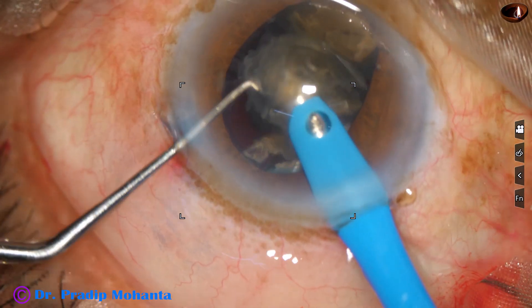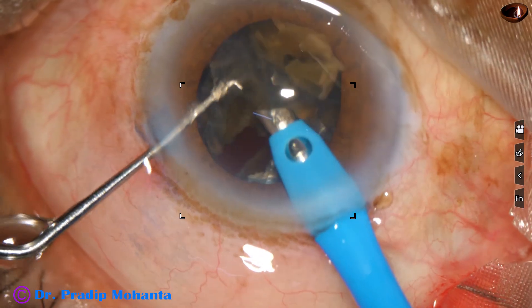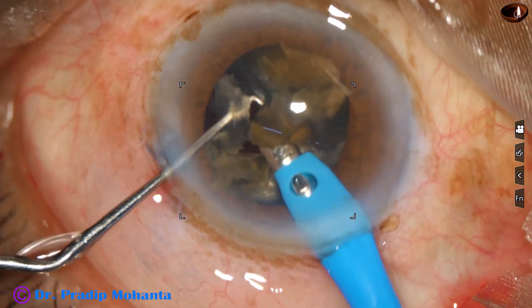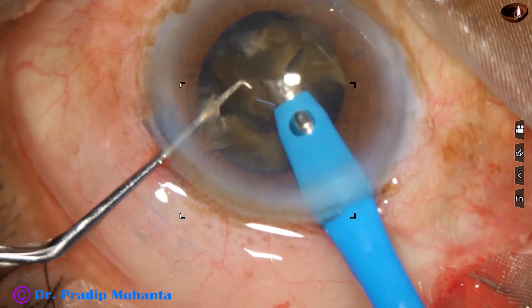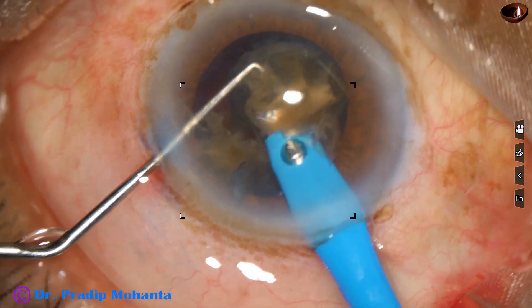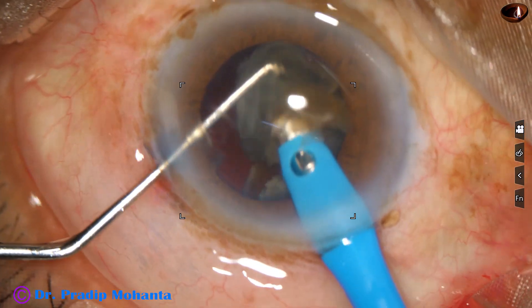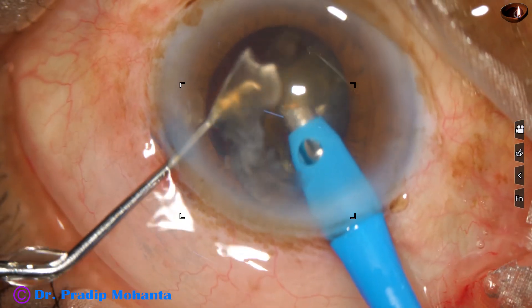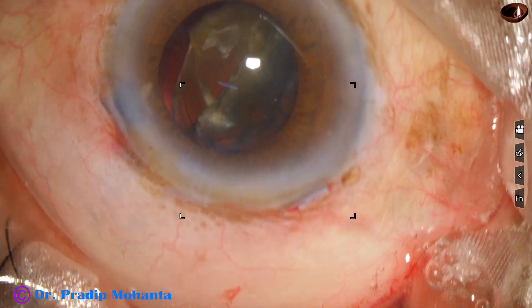Now my plan is to emulsify the pieces one by one. In such cases with a very hard nucleus and a poorly dilated pupil, we cannot see the behavior of the posterior capsule well — we cannot hurry up, we have to give time. In this case I am going to spend about 11 and a half to 12 minutes to complete this surgery. Always work at the iris plane, far from the cornea, with the phaco tip most of the time at the center. If I need to pick up a piece, I go to the periphery just for a few seconds, bring it to the central part, and emulsify at the central safe zone — because when the phaco tip is at the central part, the corneal endothelium is far above and the posterior capsule is far below. At the periphery, both are near.